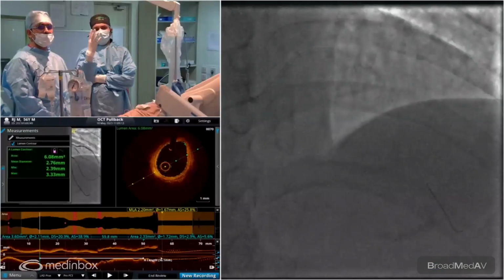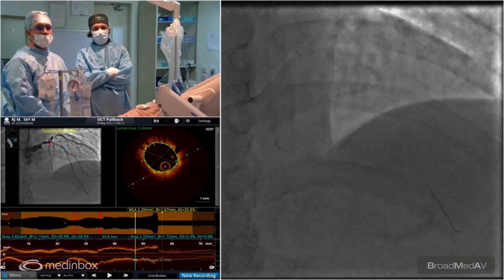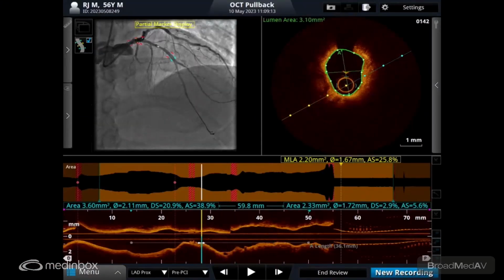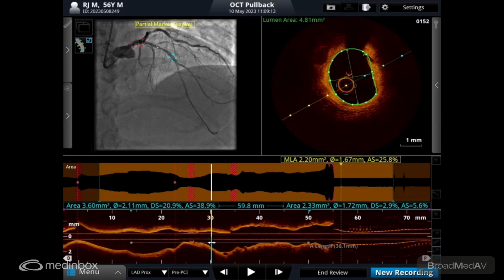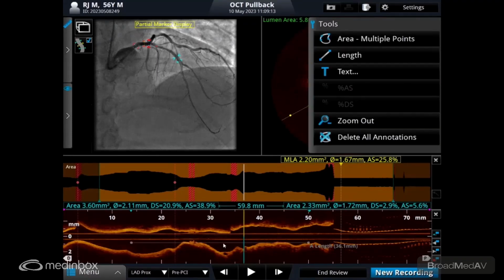No, why are you going so up? Not from the proximal, from the distal. I'm just at the distal alone. There is some NIH. Yeah, that's okay. We need from the distal end of the stent. Yeah, that's fine. So from the distal end of the stent, you need to measure to the common area at the diagonal.